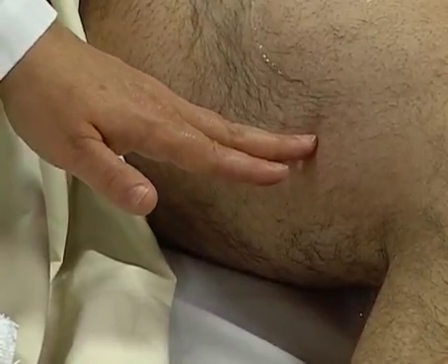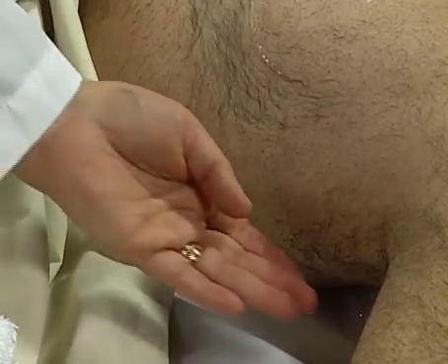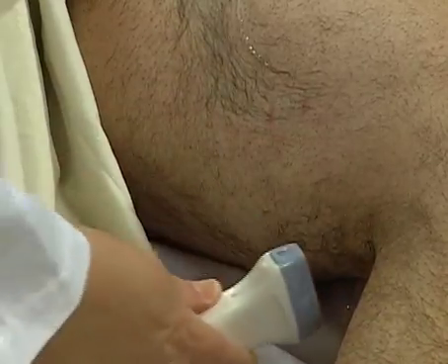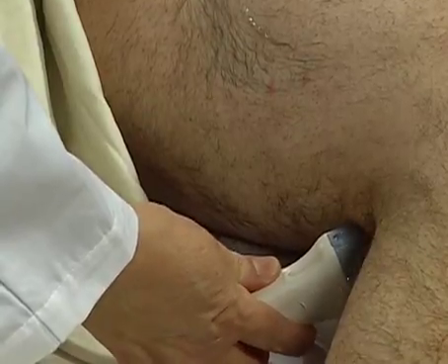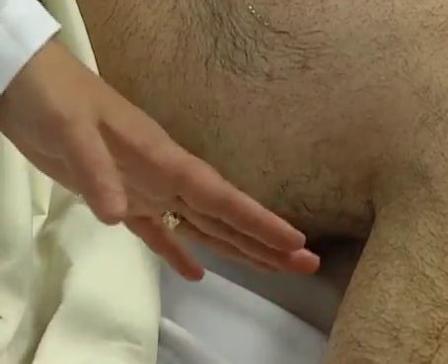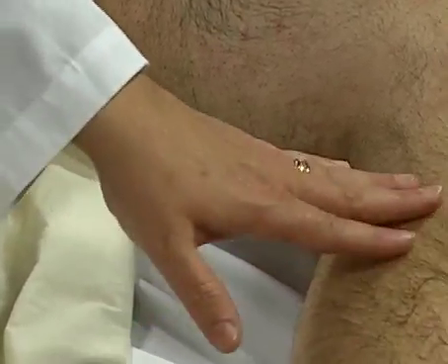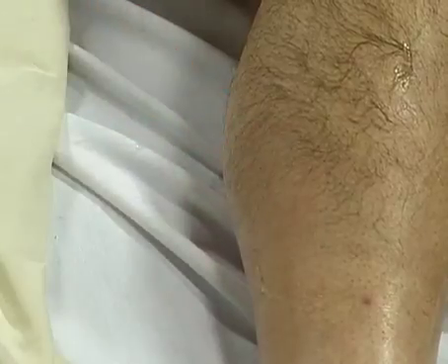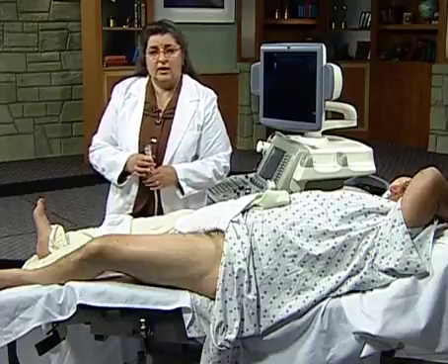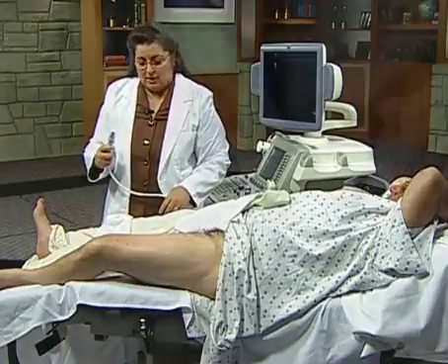At this point, we know the vessels dive deep and come up behind the leg to form the popliteal artery. So we're going to move our transducer to a more posterior approach, coming up behind the knee, as I'm showing here, and we'll evaluate the popliteal artery in through here. When we get down to the tibial level vessels, we can pretty much see the posterior tibial artery from this approach. We may be able to evaluate the peroneal artery, but more likely we'll come along more the lateral aspect of the leg and look at the anterior tib and the peroneal vessels that way.